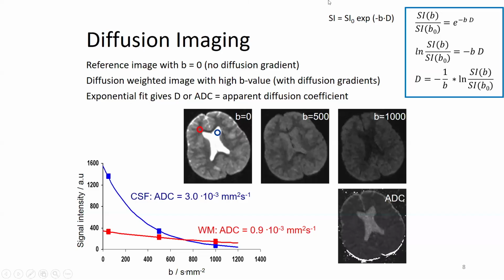Why? Well, it's nice to have an image. If I would do it here, I only have two values because I have a region of interest with, say, the mean intensity. But if I have the image, I can immediately see in the image whether things are high or low or different. So again, in the pathology cases, you will probably see it as well.